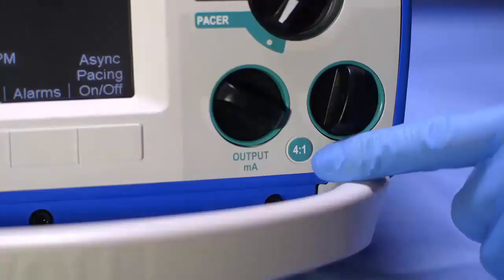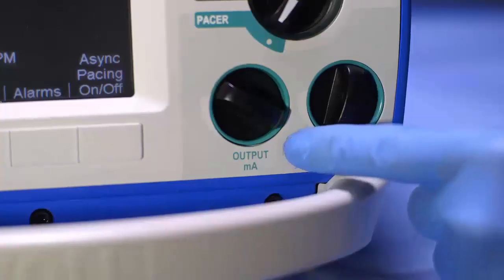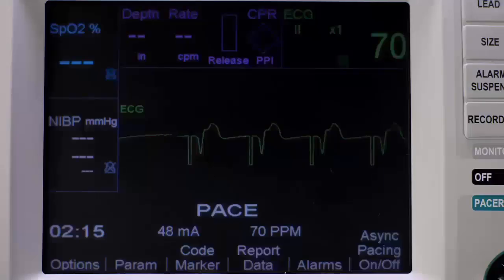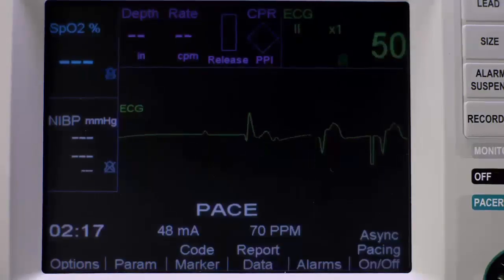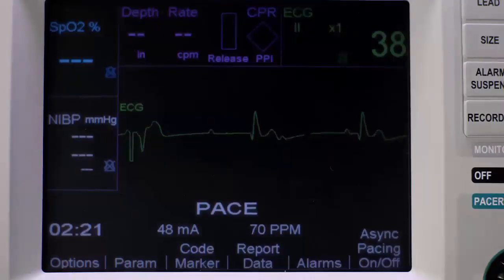At any time during pacing, you can use the 4-to-1 button to determine the patient's underlying rhythm. Press and hold the 4-to-1 button. This suppresses 3 of 4 pacer impulses to visualize the underlying rhythm without losing capture.